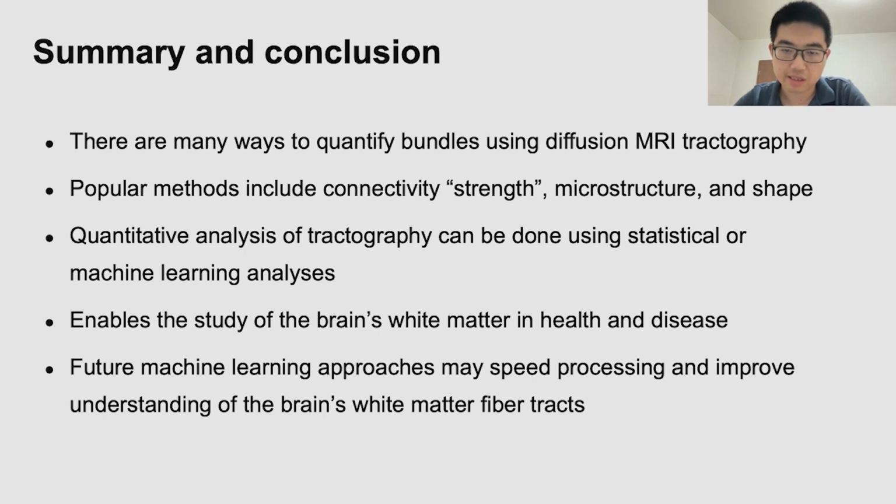Finally, as a note, I would like to say that while there have been considerable technical advancements and a broad range of applications, there still remains no consensus about the best methodology in quantitative analysis of the fiber bundles. So researchers should remain cautious when interpreting the results in research and clinical applications.